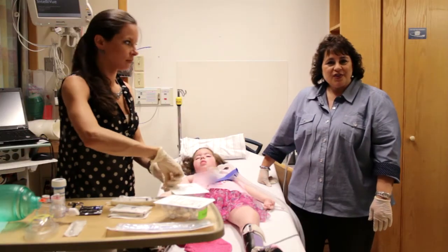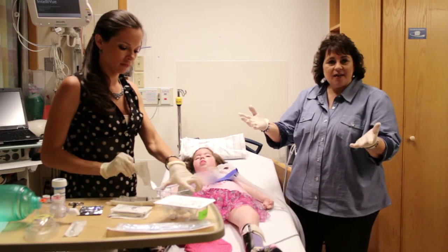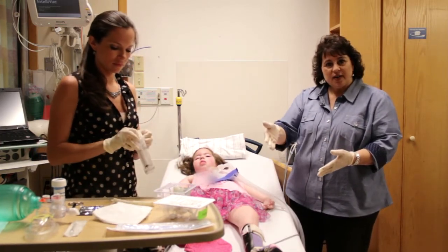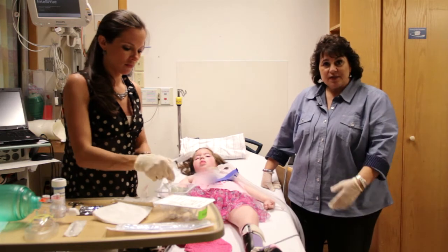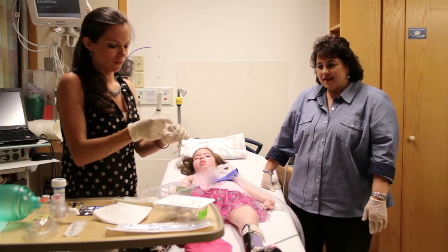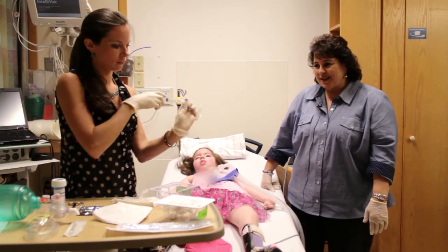The trach change procedure at home is a clean procedure, not sterile. So April and I have clean gloves on. She will, however, not touch the part of the tracheostomy tube that's going to be inserted, or try to avoid that, into Drew. But the tube needs to be checked for the cuff inflation and examined to make sure that it looks like it was made properly.